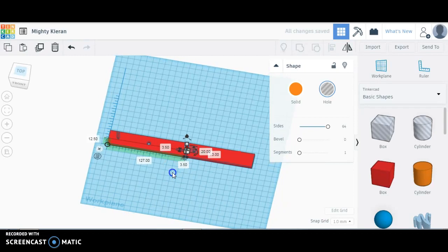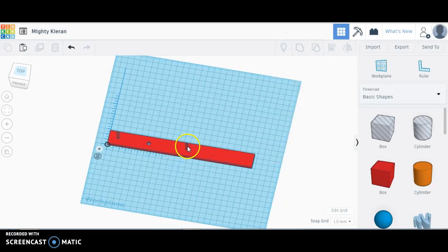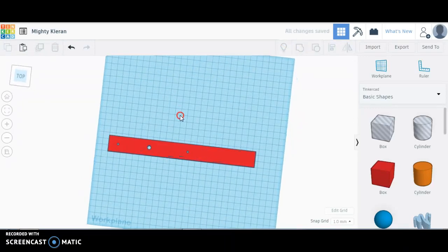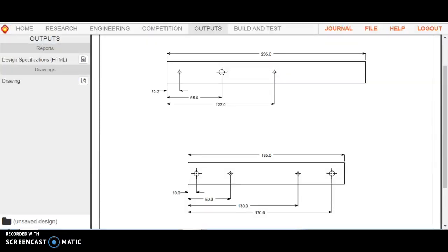Okay, all that's left to do now is to group these holes. I can close my ruler if I want. I could always bring that back. Just select everything and Control G or this button for group. And that piece, that upper arm piece at least, is complete.